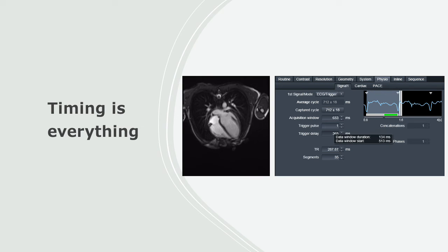So we found that a window duration of 100 milliseconds was sufficient. For 3D models, the acquisition window in diastole is ideal, but for paediatric patients, usually systole is longer and allows for a longer period of acquisition.